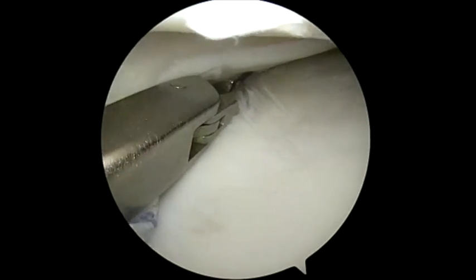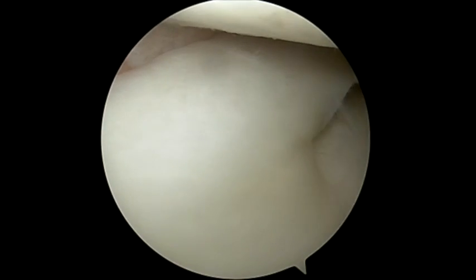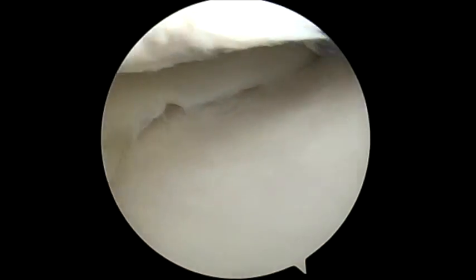We use a passing suture and pass these two suture tapes in horizontal mattress fashion through the tunnel, and this further carries the meniscus over to reduce the extrusion. In most of these patients they have roughly 4 to 4.5 millimeters of extrusion.